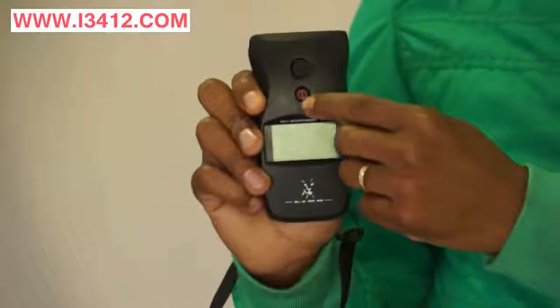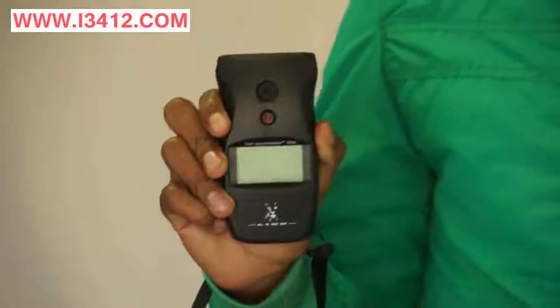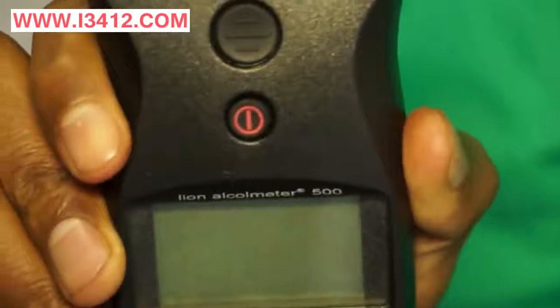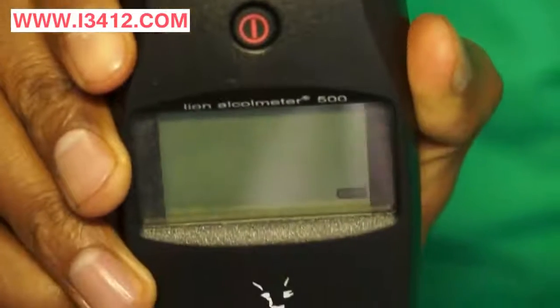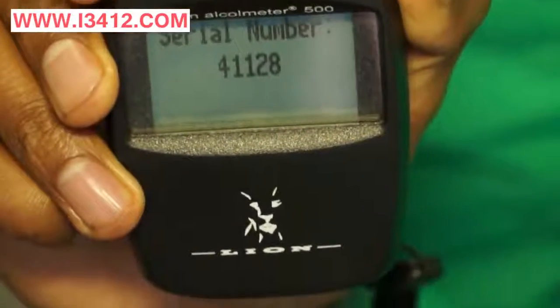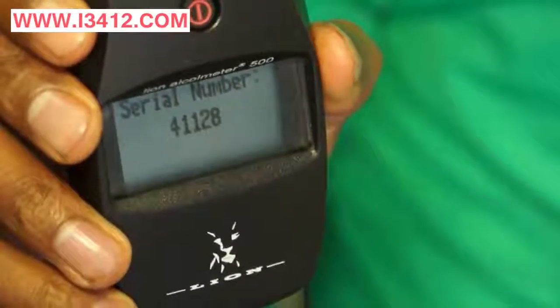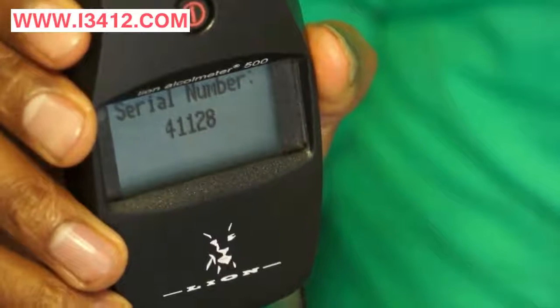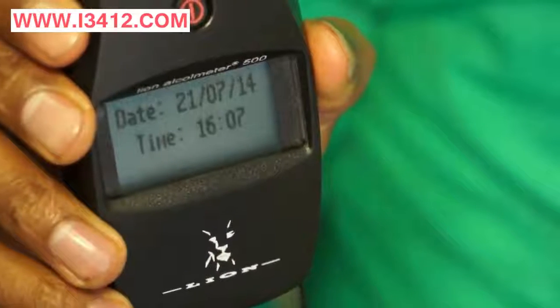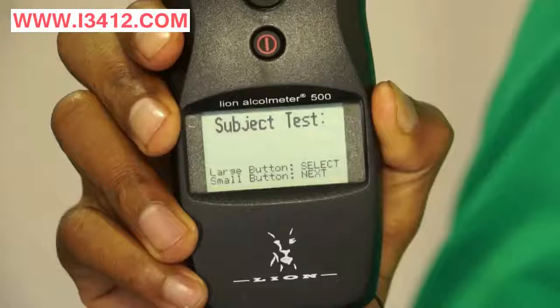To switch on the A500, you need to push the red button once and release. A click sound on startup indicates a fresh sample of air being analysed, called the blank check. The blank check is a safety procedure to make sure the instrument has not been tampered with to give false positive readings.